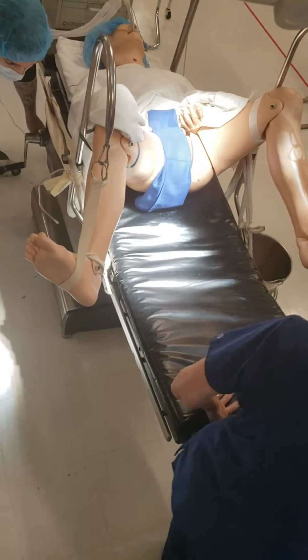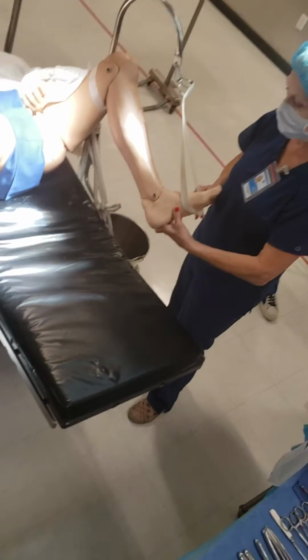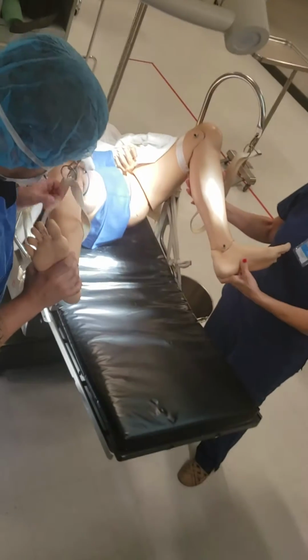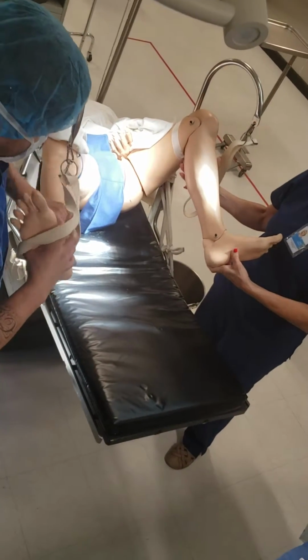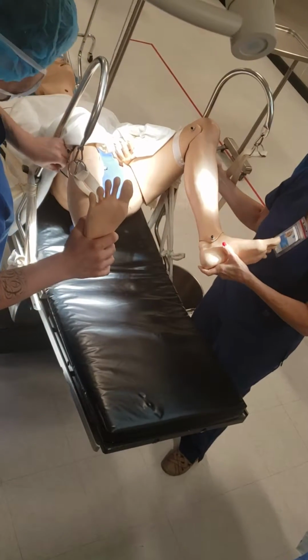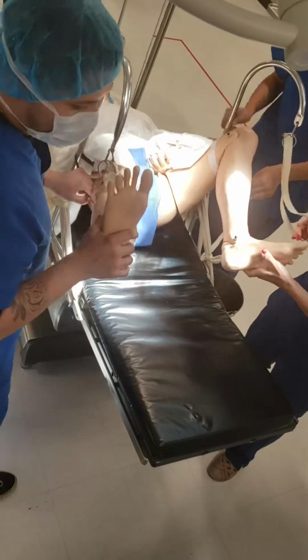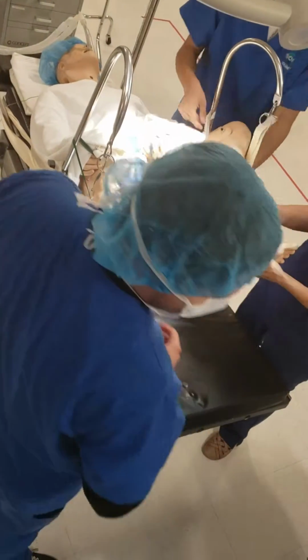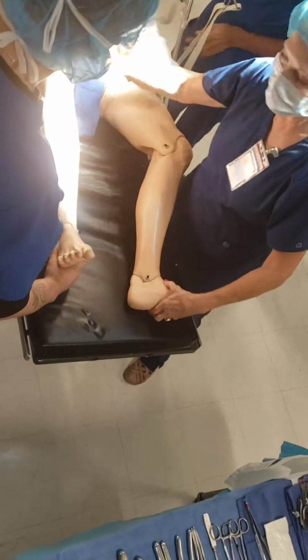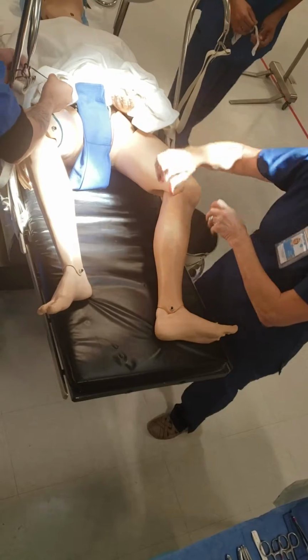Okay, good, thank you. Now, it's time to take her feet out of the stirrups, so somebody else has to be over there, and we have to release the legs at the same time. That's the ST and whoever else wants to help that's scrubbed in. The other person has to be scrubbed in, right? Not necessarily, just have gloves on. Okay, so now that we've done that, both legs can come down at the same time. Just as when we're ready to put her legs up in the stirrups, both legs go up at the same time.